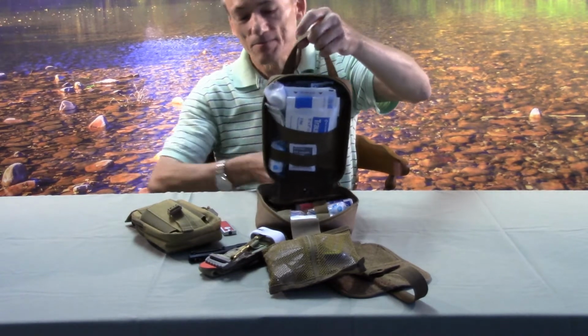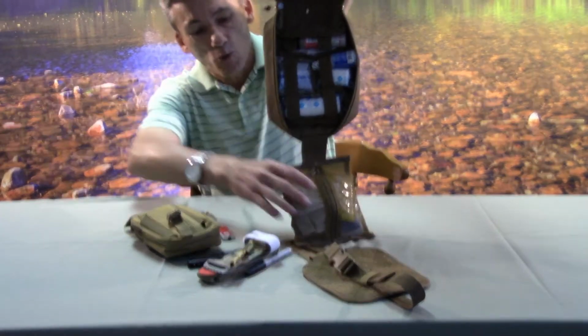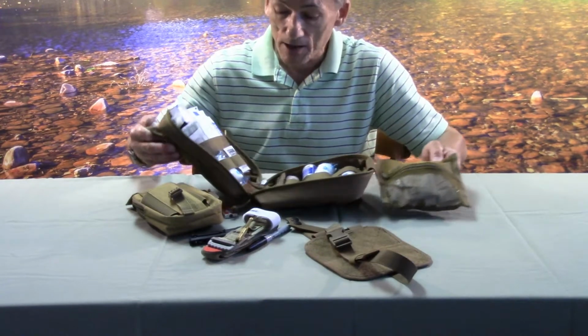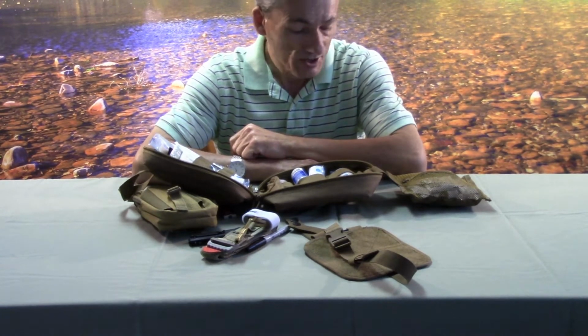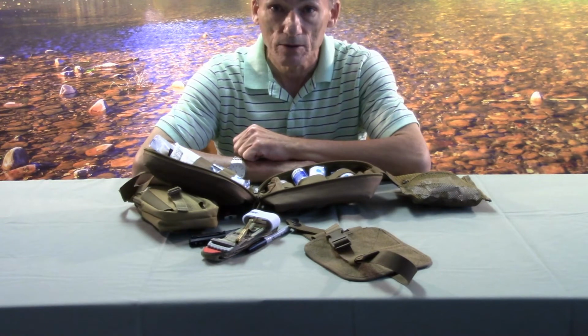Anyway, there's a lot of possibilities as far as how you can hang this up, and it will just open up and expose all the contents. Now, if you're working on yourself, in all likelihood, you're probably just going to turn it sideways. You've got everything laid out here where it's easy to access. And let's just get into some of the contents that personally I feel are important.